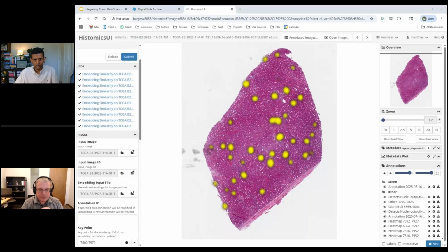So that's part of this where, for your data science side of things, the data processing is not the work that needs to be done before we can do the real work. It is often the real work that needs to be done, and that's just part of how you get your data for your project.